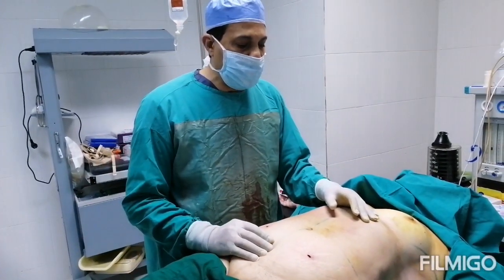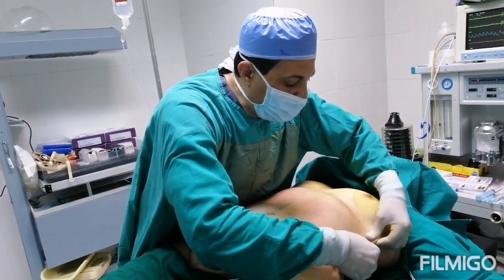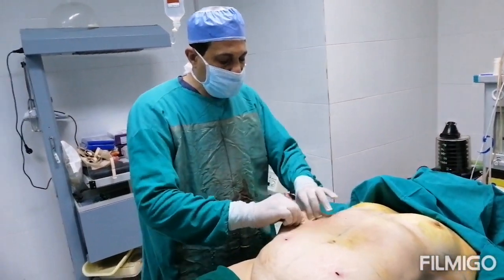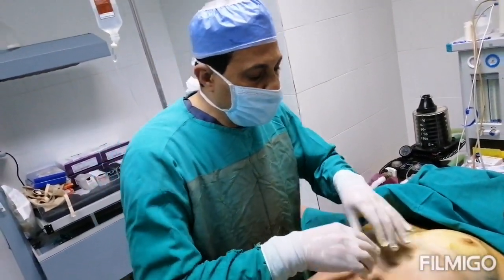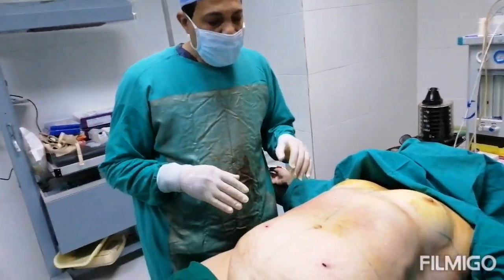Now we have finished the liposuction area. As you can see, this area is already empty of fat. The amount of fat is reduced — we tried to reduce the fat in the waist and the surrounding area so it will give a good shape after we do the tummy tuck.